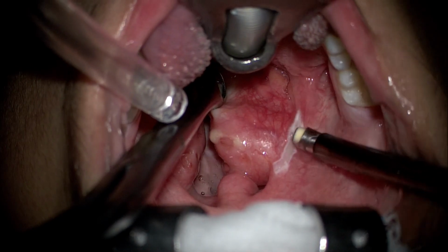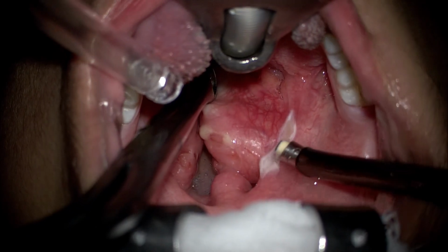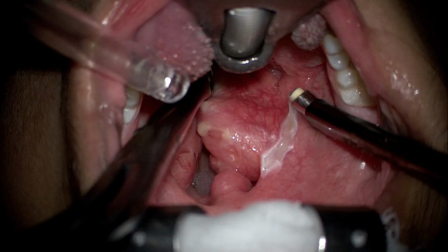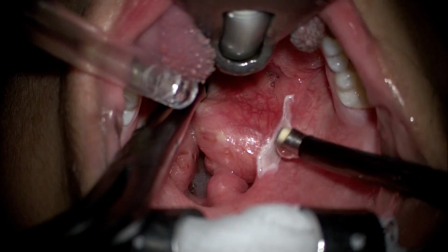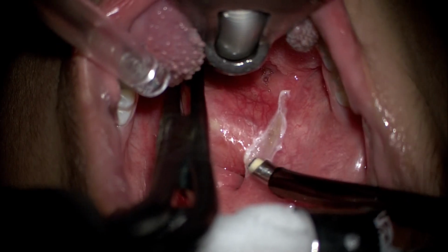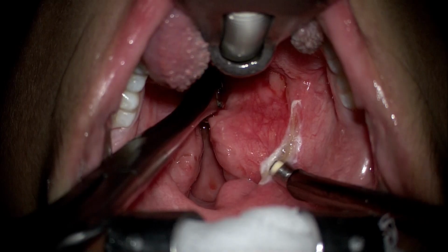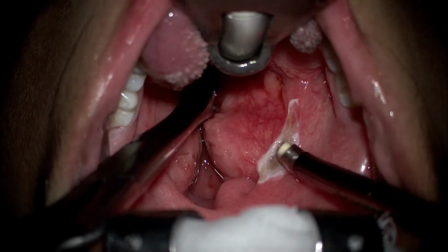As we can see here, the first step is using the coblation device. We are using an EVac HP wand, and the first incision using the wand happens at the junction, or at the lateral border of the tonsil that differentiates it from the anterior pillar. One thing to remember always is that the face of the wand should always face medially towards the tonsil and not towards the tonsillar bed, because that is not the place for a dissection. We are doing this under microscopic control for better vision.